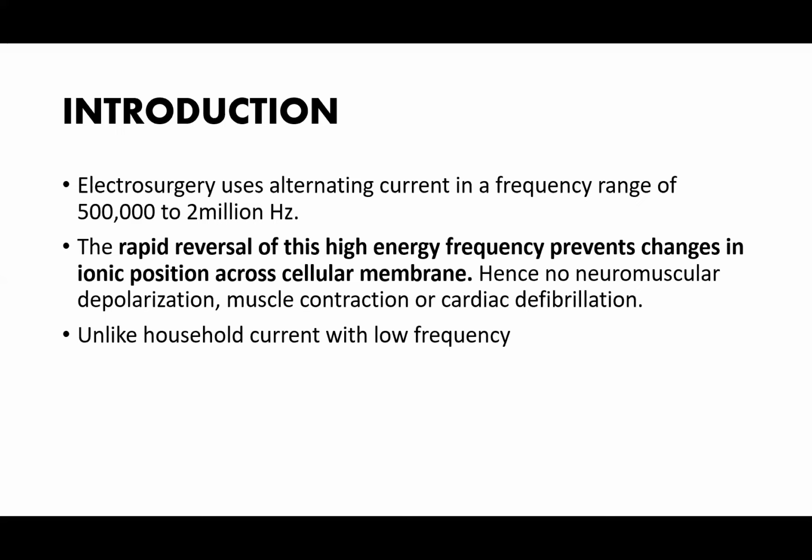Hence no neuromuscular depolarization, muscle contraction, or cardiac defibrillation, unlike our household currents with low frequency. So the high energy frequency that is used in laparoscopic surgery has this tendency of rapid reversal. Hence, they do not cause all these effects on neuromuscular tissues.